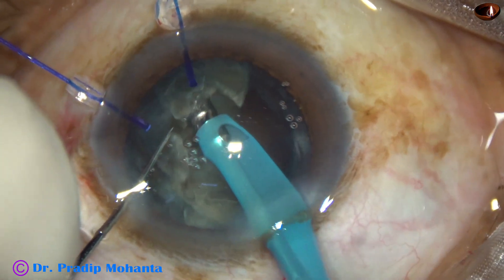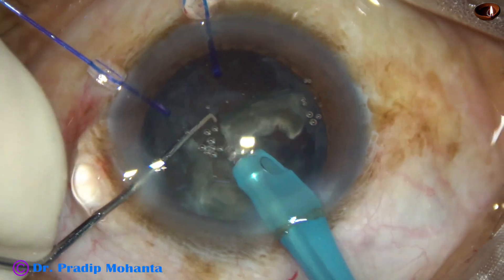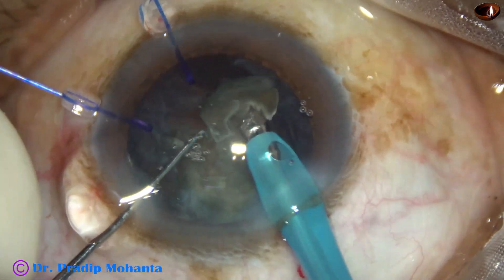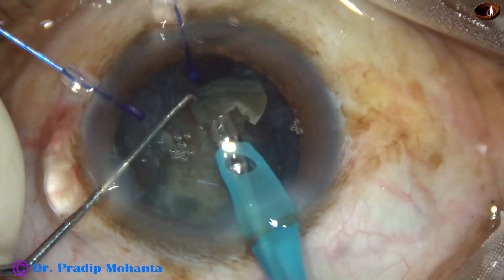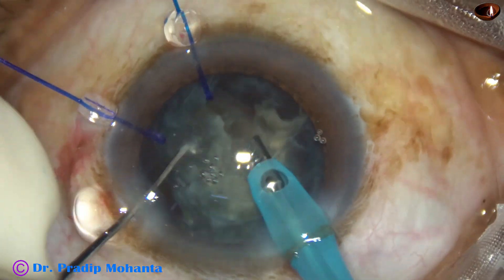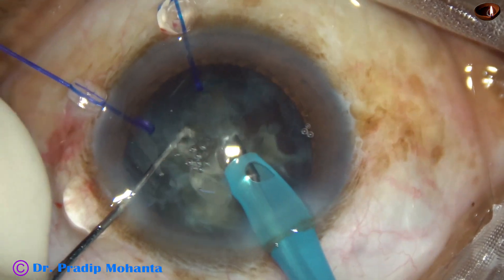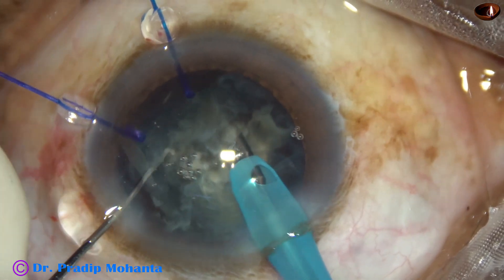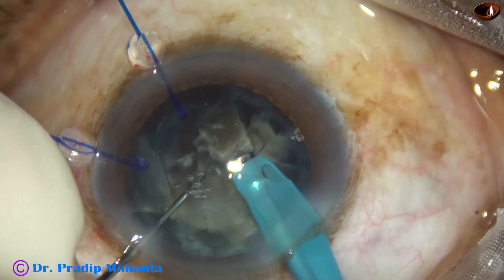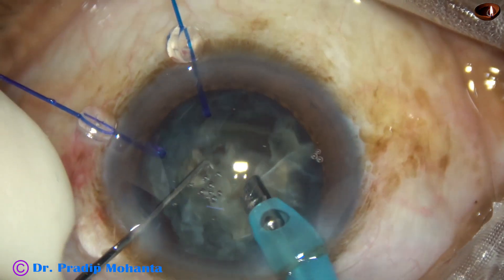Management of this nucleus is ongoing. This patient has a history of blunt trauma. In traumatic zonular dehiscence, we can manage with a capsular tension ring because there is less chance of the lens-capsule complex dropping in traumatic cataracts, as the remaining zonules are quite healthy.